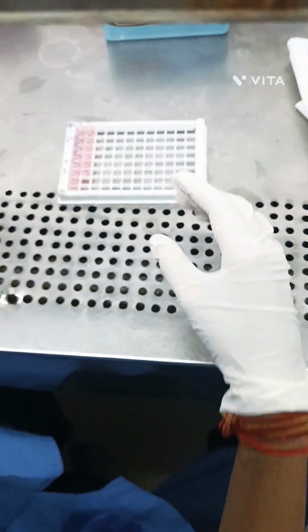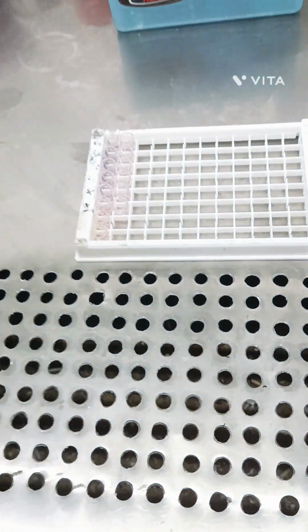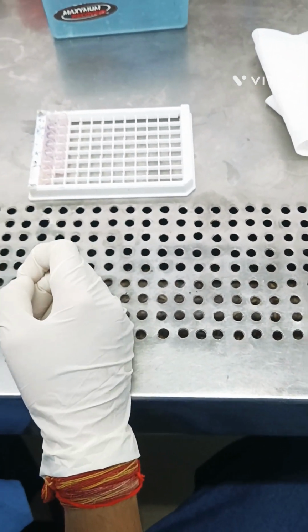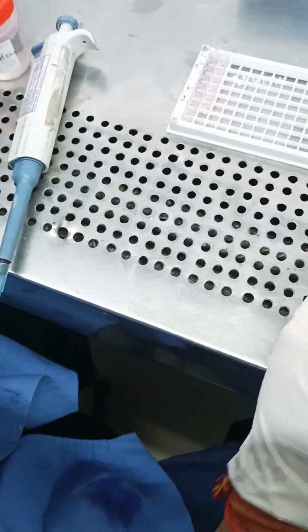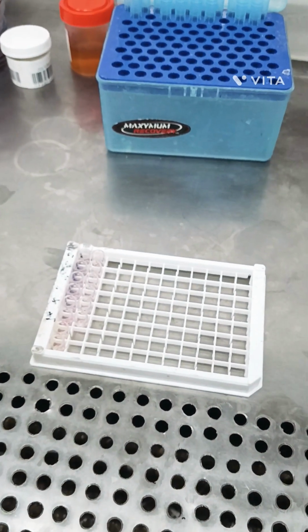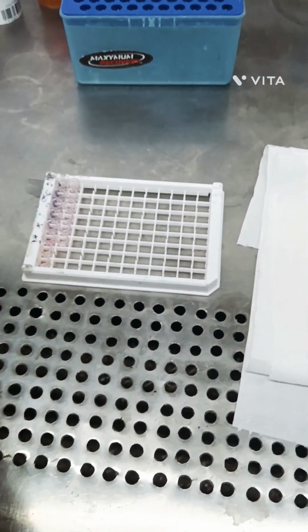So after 60 minutes is completed, open and wash 5 cycles with wash buffer. First, take tissue rolls, because in washing we need tissues for blotting.